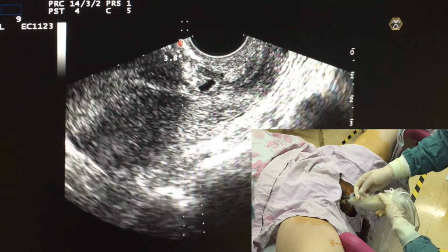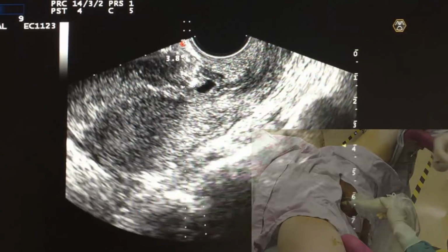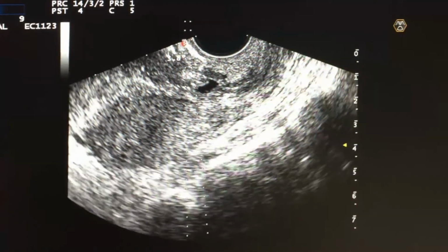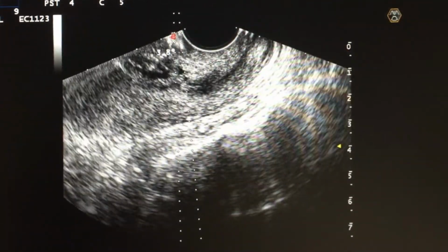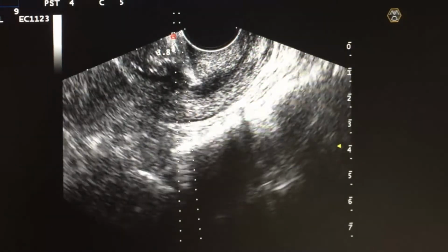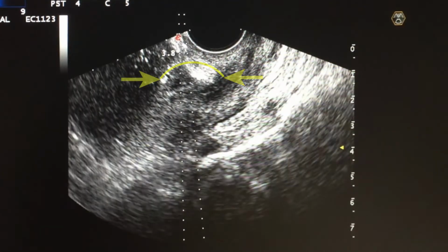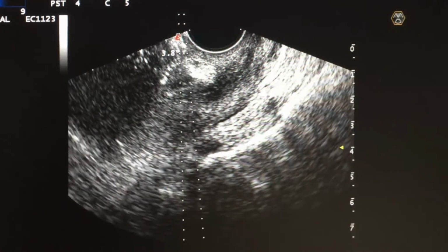After injection, we reinserted the stylet and slowly withdrew the needle. This process was repeated a total of 3 times until the near syncytial trophoblast region was filled with the sclerosant, thus achieving a cap-like hardening effect. A total of 8 mL of sclerosant was injected.